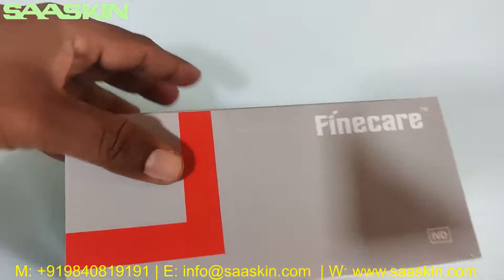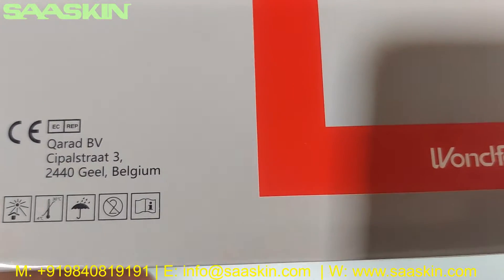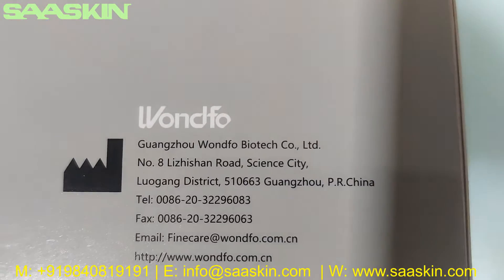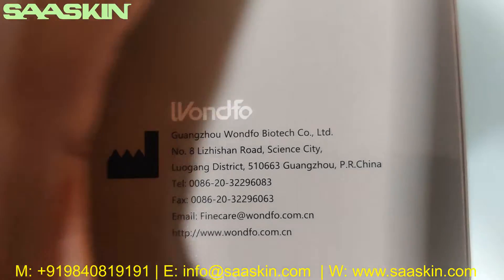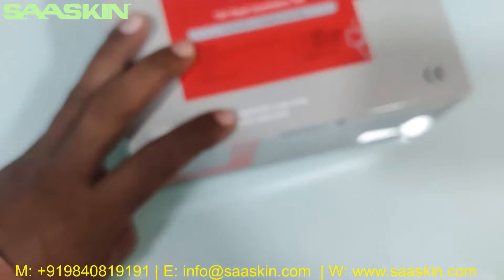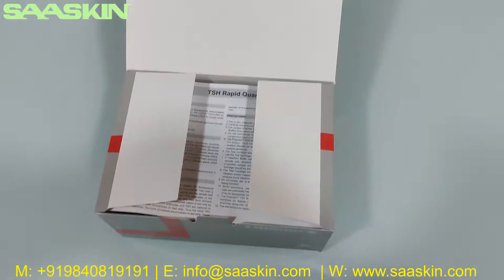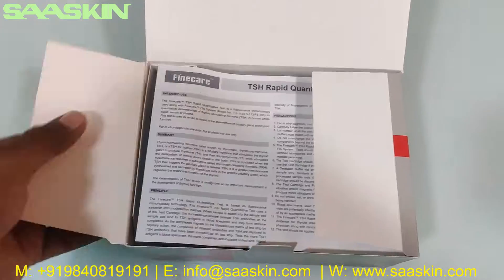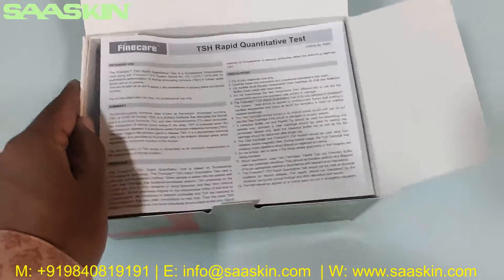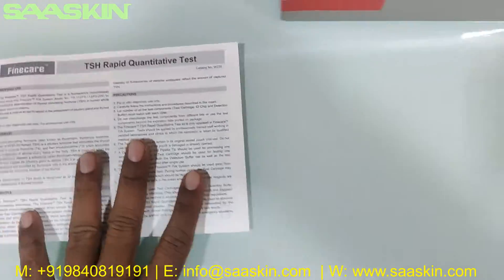The box shows the manufacturing location from China. I'm going to unbox this for you. Inside the box, you can see there is an instruction for use leaflet.